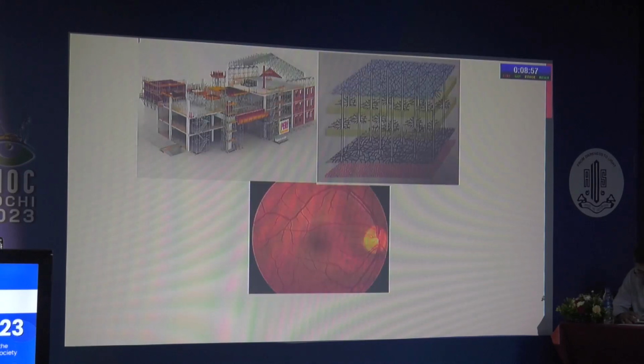I'll just give you a basic guideline on how to interpret your OCT findings. You should visualize a retina like a building coming up. You have beams, you have pillars. So all your horizontal structures are like beams, and the columns are your Muller cells. As we all know, they guide the pathologies in the retina to appear differently. A flame-shaped hemorrhage appears in the neural retina, whereas a deeper retina will give dot and blot hemorrhages. So you must interpret OCT this way, because the retinal structure is like a building coming up.